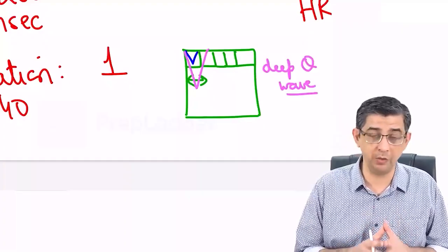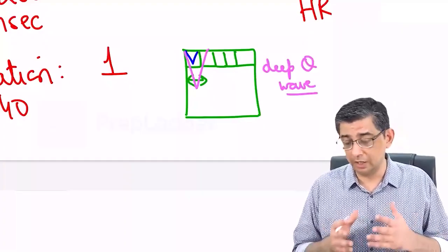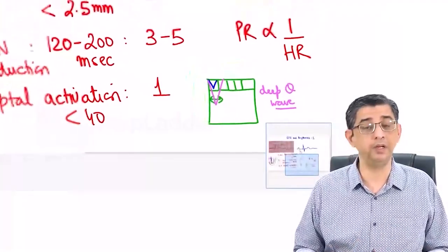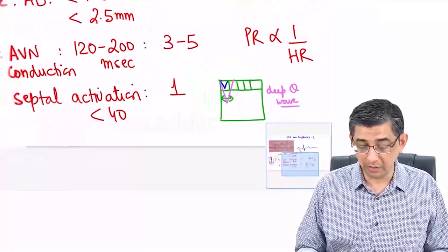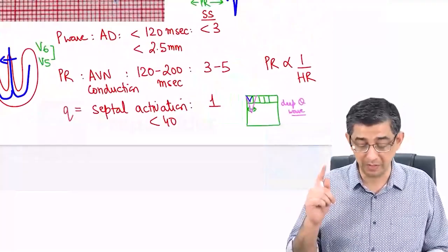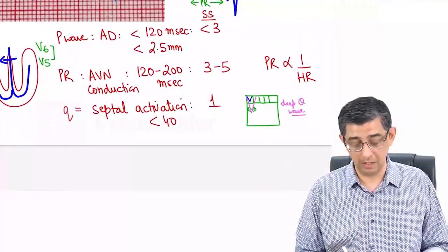But one I can remind you right now is myocardial infarction. Deep Q wave signifies cell death, and this finding is never ever going to go back. I mean, in MI, when you read about the ECG findings, most of the findings will gradually begin to regress, but deep Q waves will persist for the whole life of the patient.